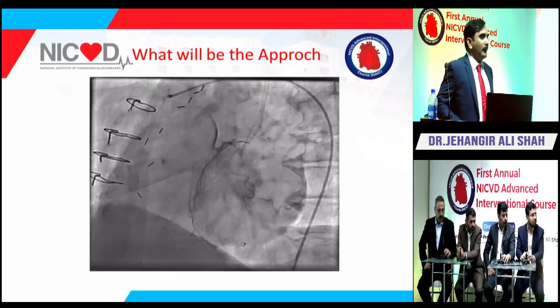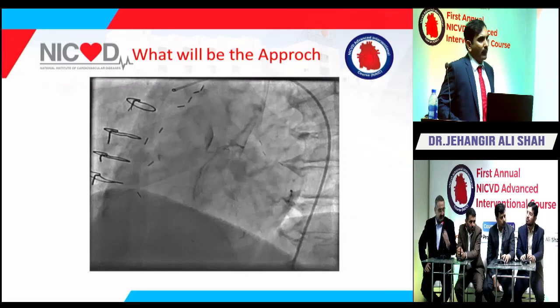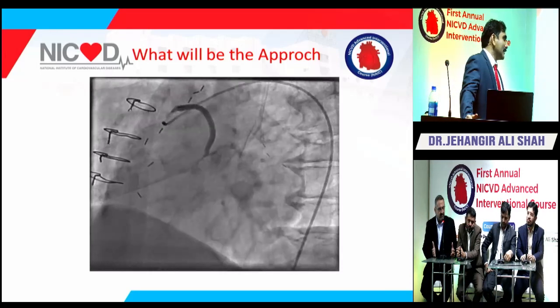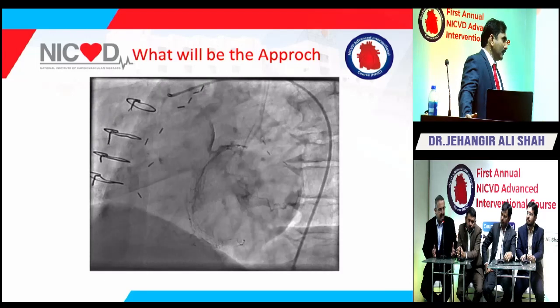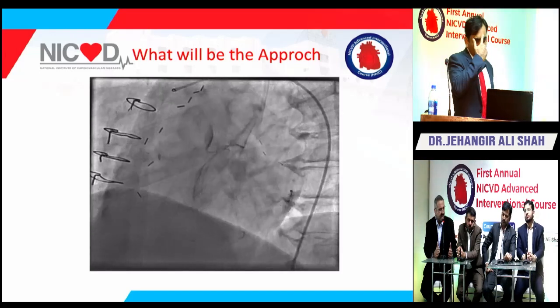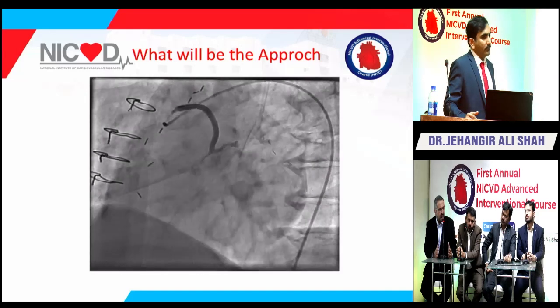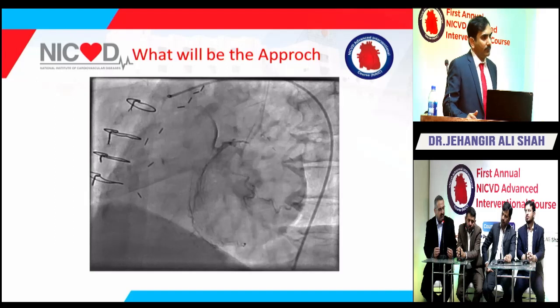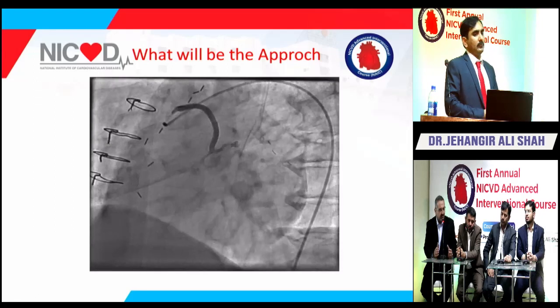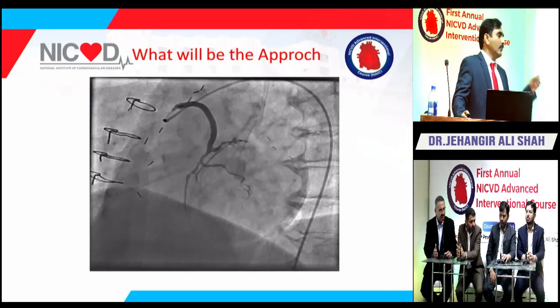And what's the risk? That's a great question. It is recommended based on different studies that were conducted. They found that comparing a 1:1 or oversized stent versus an undersized stent, it is not absolutely necessary to approximate the stent struts to the vessel wall of the SVG, because if you do that, there is a greater chance of distal embolization and plaque prolapse. So the results were quite good in patients who received undersized longer stents. That's in a study, evidence-based.